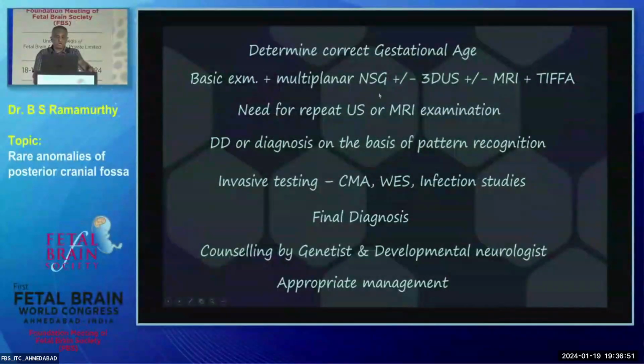And I would strongly exhort everybody to take to transvaginal scan. Be a little patient. There are times where we've made a patient wait until the head has come down. I'm not an obstetrician. I don't have the guts to do external cephalic version. No, I can't do this. But you can call her on another day, wishing and hoping that the head comes down.